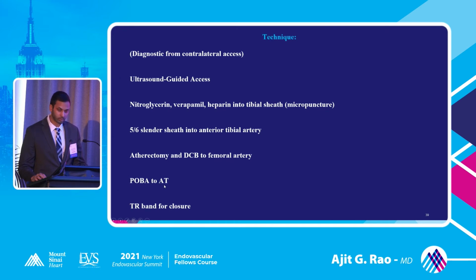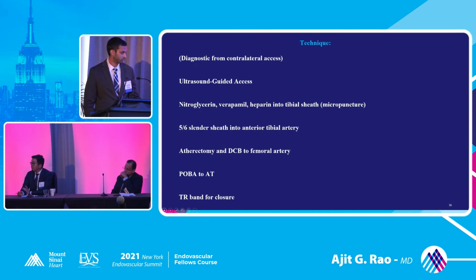Patient had a relatively skinny ankle, so we were able to get a TR band on it for the closure. Can I ask, Dr. Rao, while you're doing this, you showed that the dominant runoff to the foot is the AT, but you did see PT that came down to around the mid-ankle. Why not stick to PT rather than treat the access from the dominant vessel?